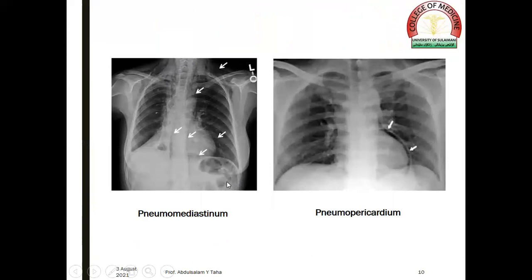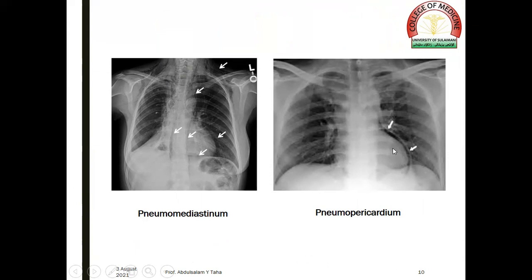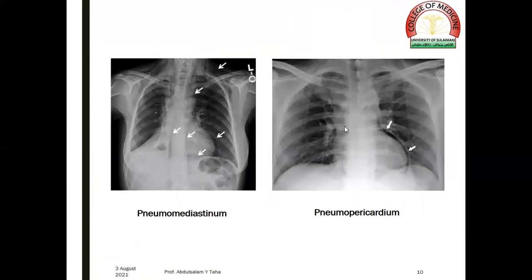Pneumomediastinum refers to the presence of air in the mediastinum, which appears as a radiolucent shadow, like in this film, which extends also to the region of the neck. Pneumopericardium is the presence of air in the pericardial sac, like in this film.